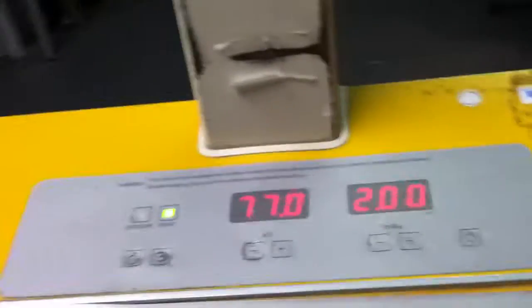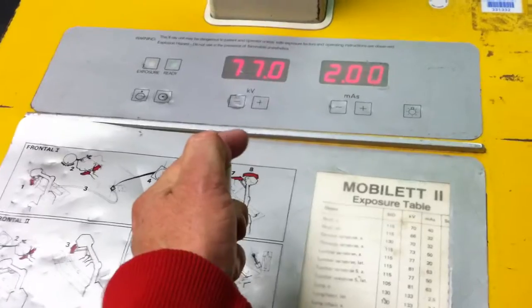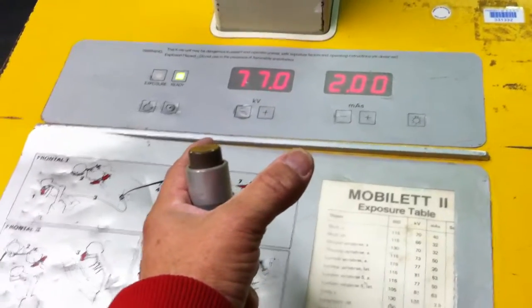Alright, the calibrator. That shows that it's working.